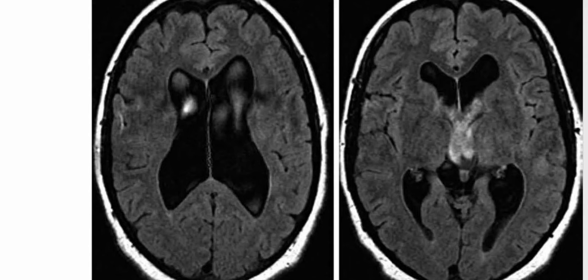So a young adult woman presenting with cognitive impairment and ataxia. These are the images. As you can see, the axial FLAIR sequence shows enlargement of the lateral ventricles, the third ventricle and the fourth ventricle, with hyperdynamic CSF flow signal intensity.